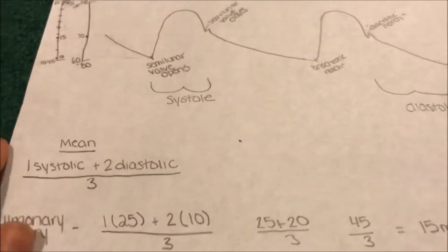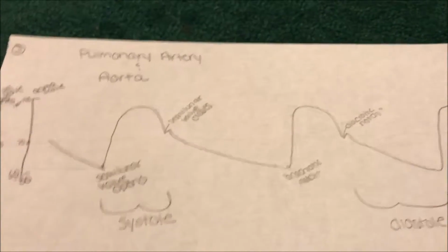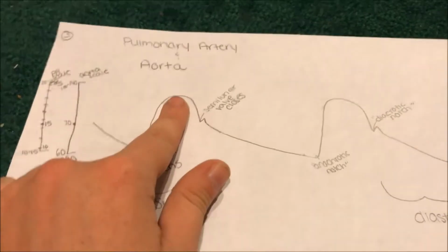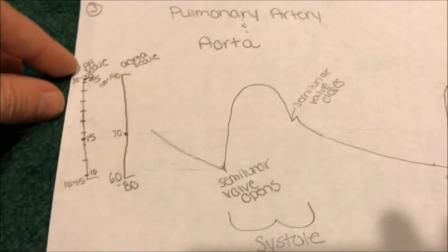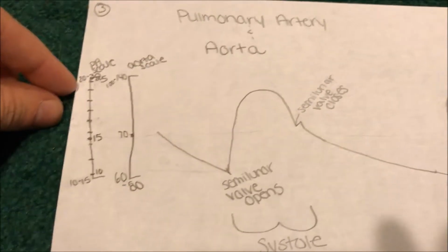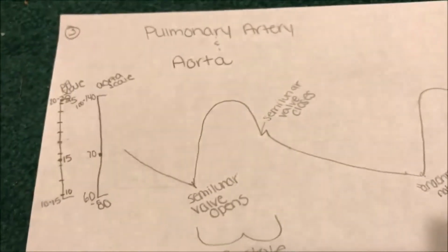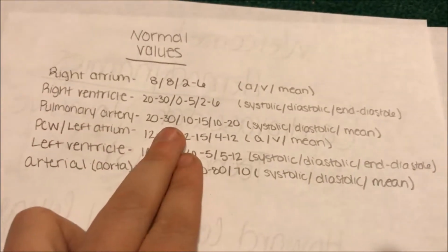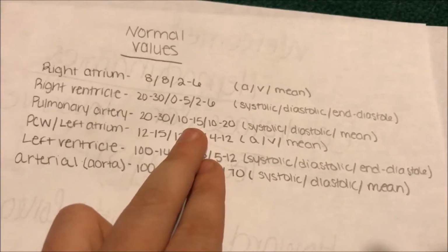So to figure out the systole, diastole, and the mean. First of all, systole we can say is the top part of systole, so this is the higher pressure. And when we go across, say we're in the aorta, I did scales, so pulmonary, this would be pulmonary artery, which would be around 20 to 30 would be the top. Aorta is 140. If we look here, same thing, pulmonary artery, the systolic, which is the top part, should be about 20 to 30. The diastolic, which would be the bottom part, should be about 10 to 15.